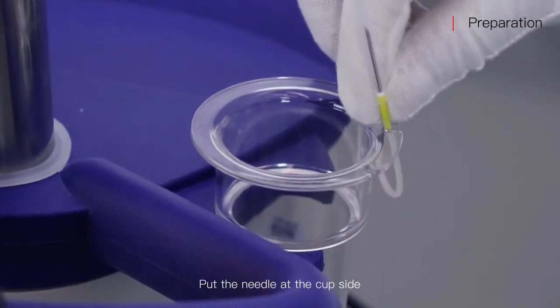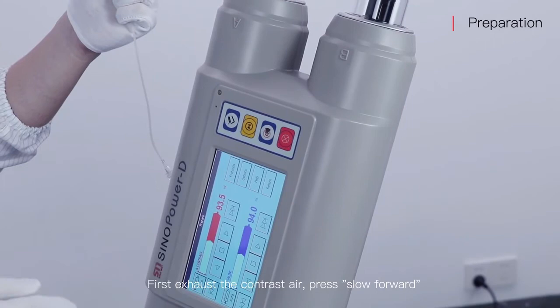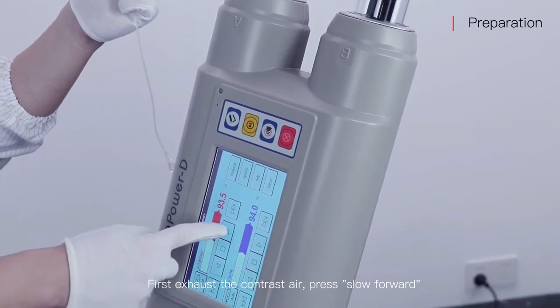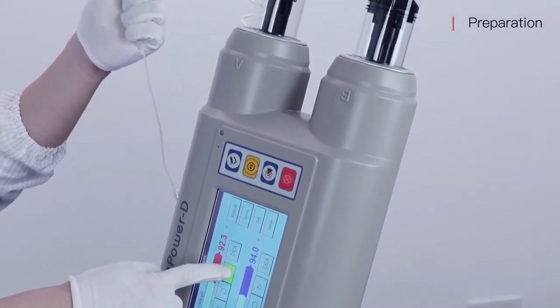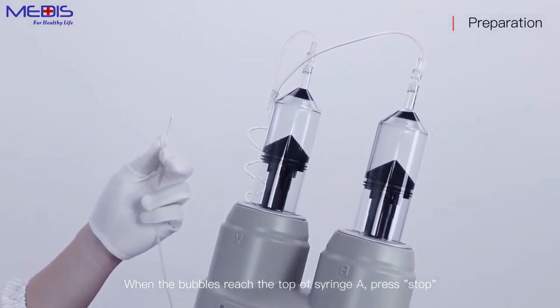Put the needle at the cap side. First, exhaust the contrast air — press slow forward. When the bubbles reach the top of syringe A, press stop.